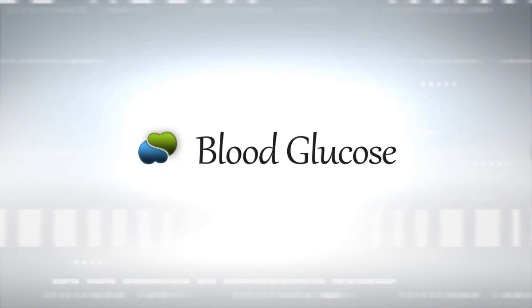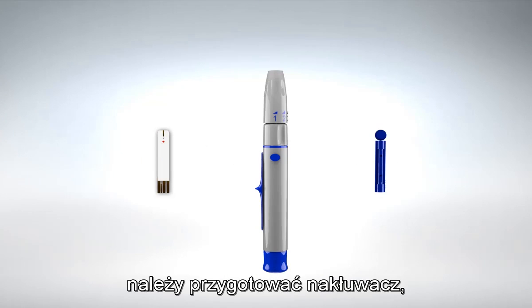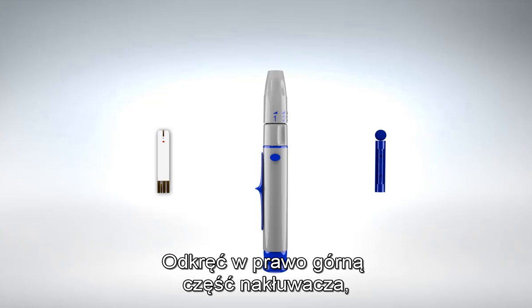Blood glucose. In order to test your blood glucose level, please prepare the lancing device, the lancet, and a new glucose strip.